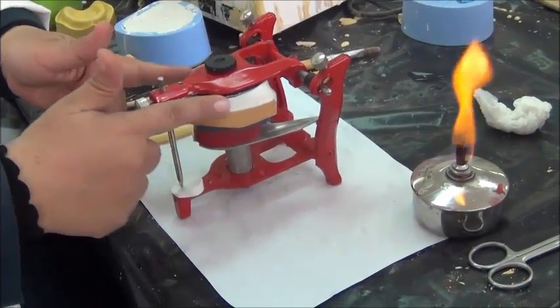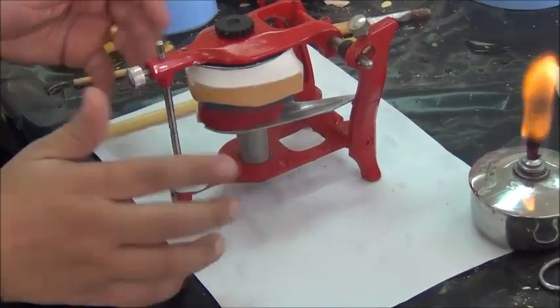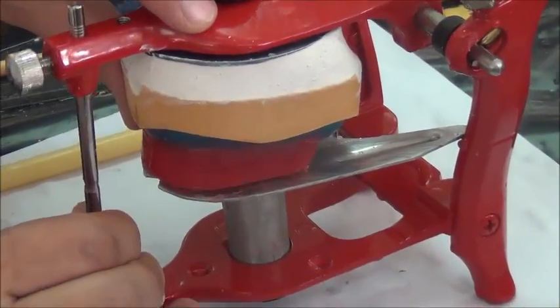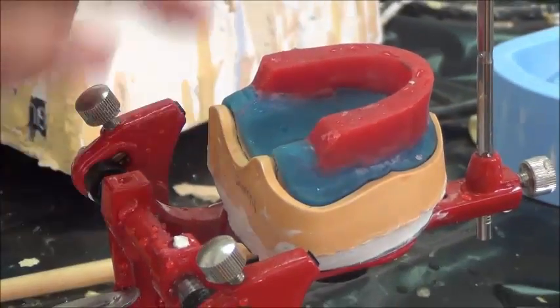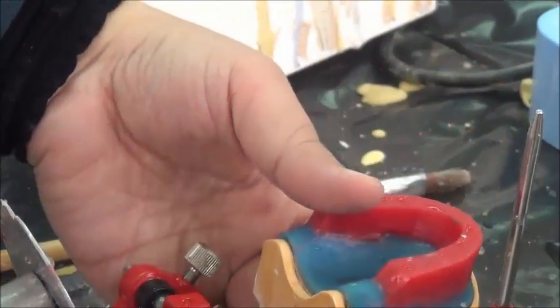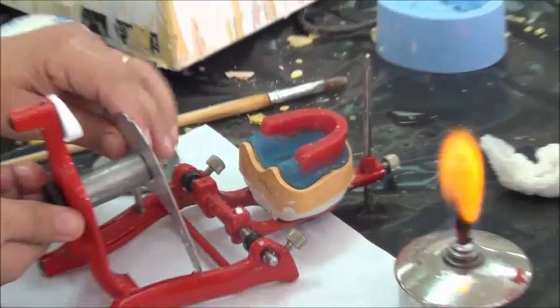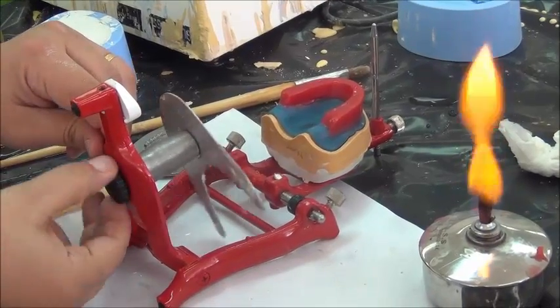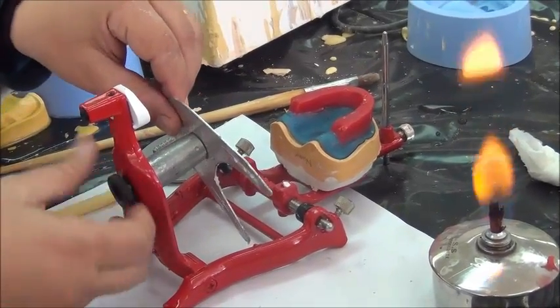And now once it's set and we have cleaned all of the members, we are able to open this securely. And now we have the upper member here. For mounting the lower, we are going to first take off our mounting jig. This is a removable part. There is a screw beneath your articulator where you can just unscrew it.